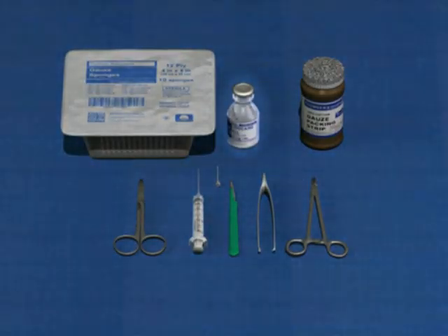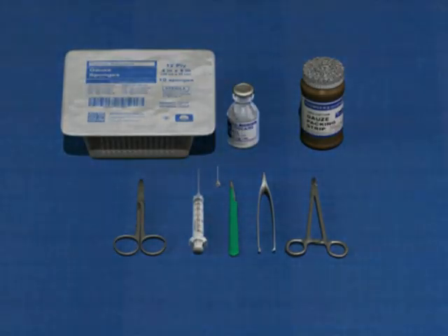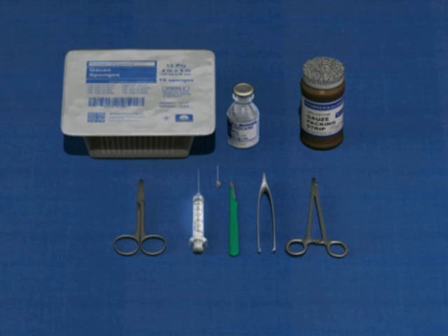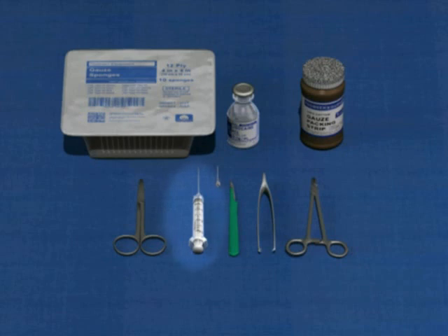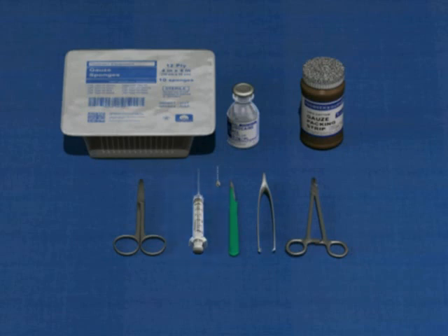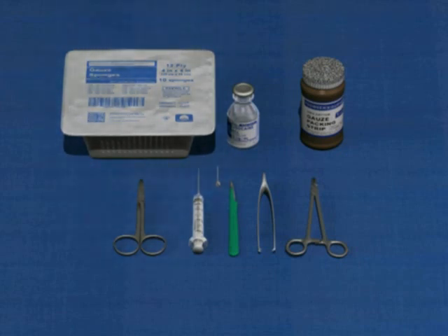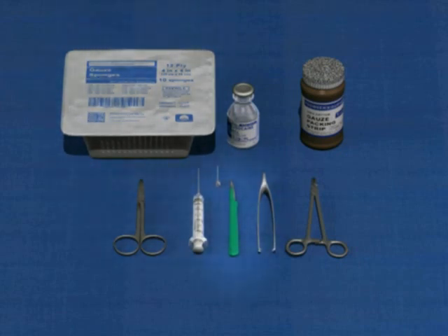The equipment includes local anesthetic such as 1 or 2% lidocaine, a syringe with a 25 to 30 gauge needle usually one-half to 1 inch in length, since only the skin over the abscess is anesthetized, an alcohol or povidone-iodine wipe, 4 by 4 inch gauze, and a number 11 or 15 blade scalpel.